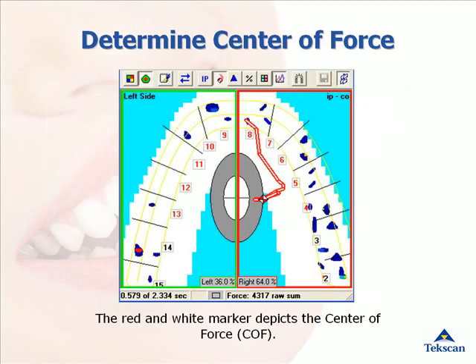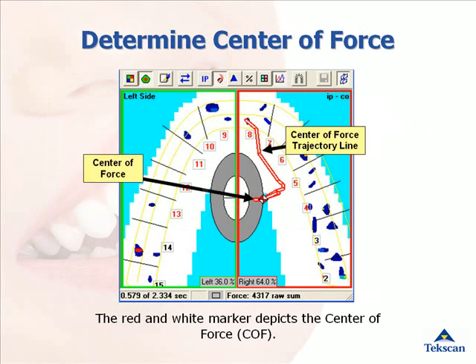Each T-Scan recording has a center of force trajectory line that displays the history of the patient's bite. The center of force is a timeline of what happens throughout the path of closure. Each segment of the center of force trajectory line represents one click of the mouse, or one hundredth of a second in time. For this patient, most of the force begins mid-arch left side. As the occlusion comes together, the posterior right side occludes, bringing the center of force to the center. However, as they continue to close, the left side picks up more contact, pulling the center of force posterior left. This is an obvious case of occlusal timing issues and lack of balance.